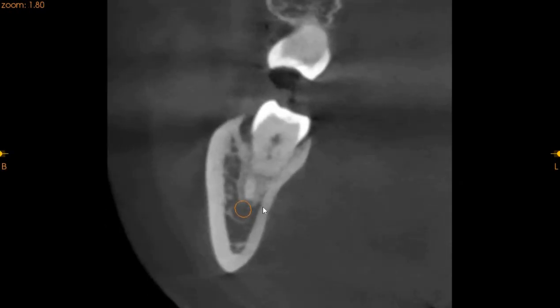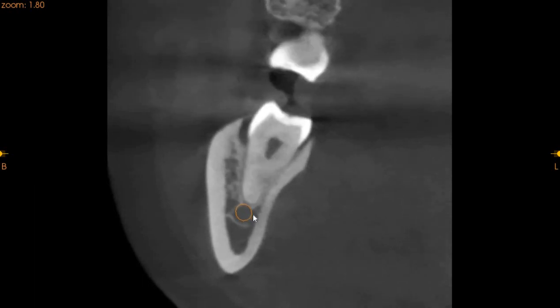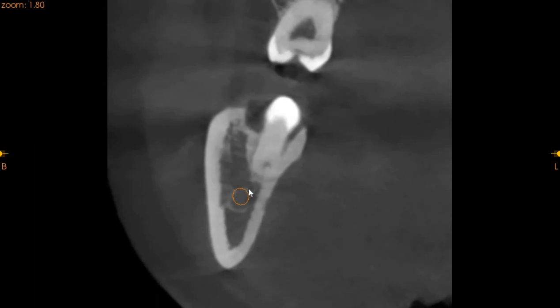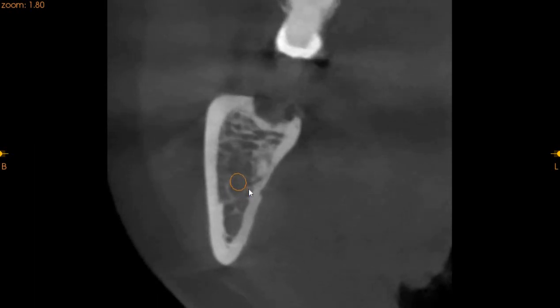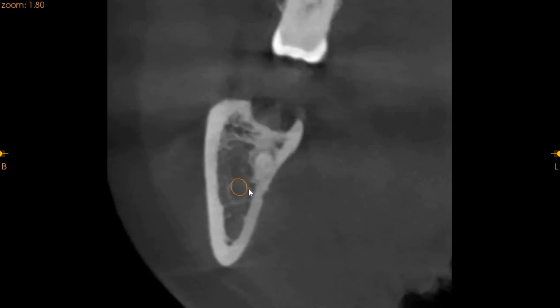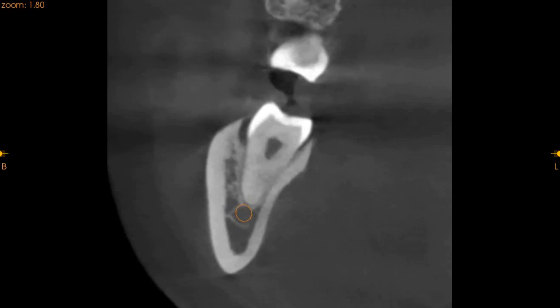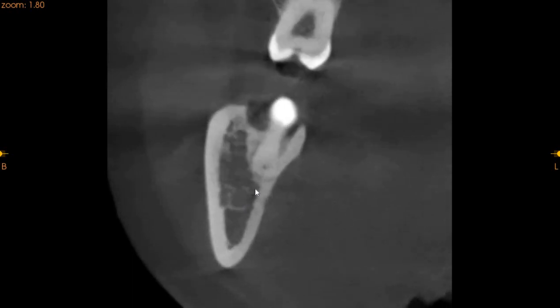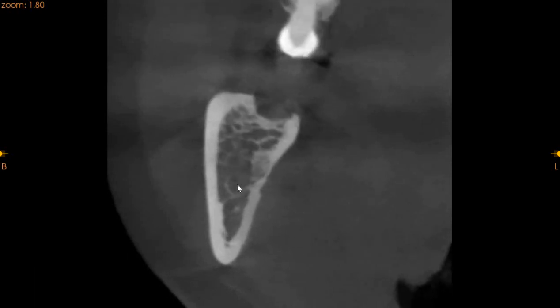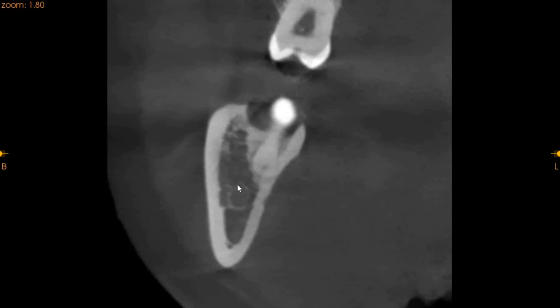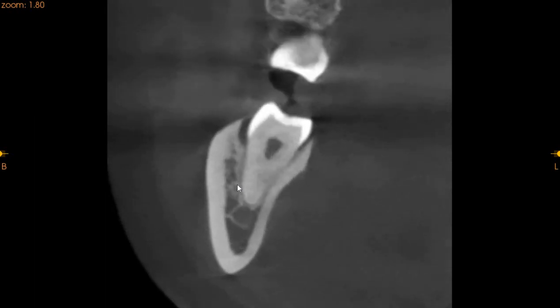Now this is the lower left wisdom tooth. The inferior alveolar nerve is below or inferior to the apex of the wisdom tooth. As we are moving distally, we can see that the inferior alveolar nerve is not in any kind of compression — it is very closely associating. We can turn the nerve tracing off. This is the inferior alveolar canal and you can clearly see as we are moving back, the inferior alveolar canal is not being compressed. The architecture is intact and hence the extraction of the lower left wisdom tooth should go uneventfully because it is not compressing the inferior alveolar nerve at any point.